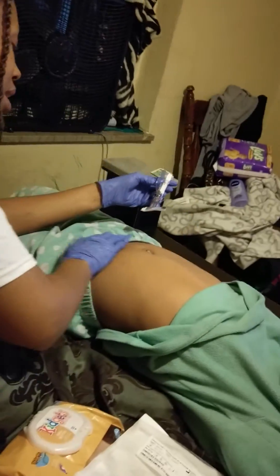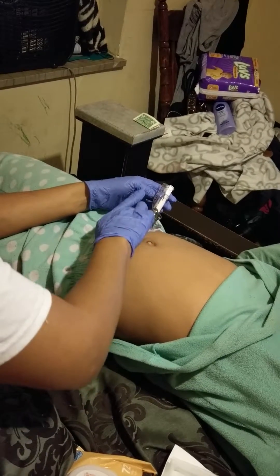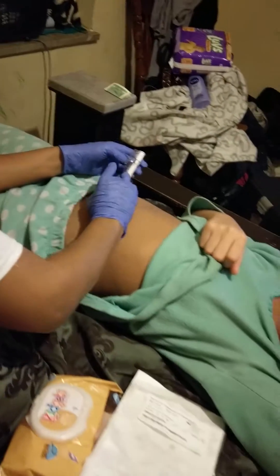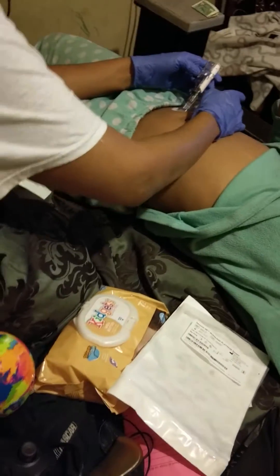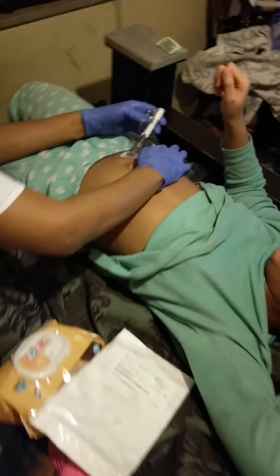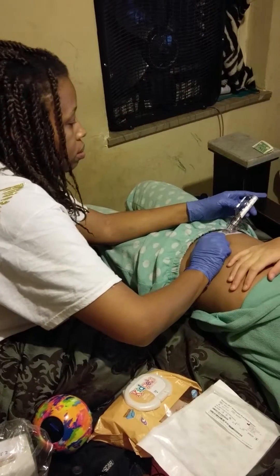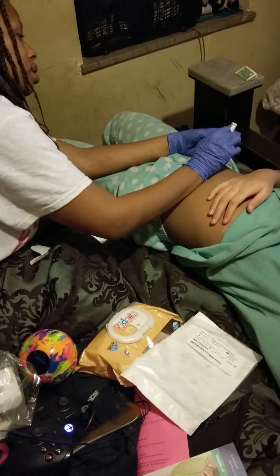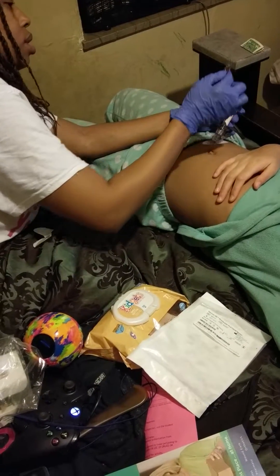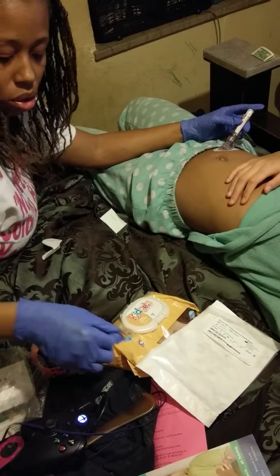Okay, now we've got to apply the applicator. Now what you hear in the background is my brother and his sister and the dog. You have to hold on to this — this is going to later help take the transmitter off.